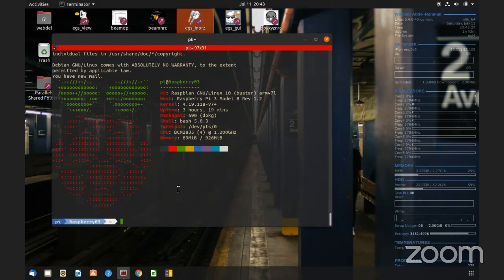With the EXB, it's a new way of parallelizing things. Basically, it does it in a smart way. It has like a basket, let's say of 10 million. And then each program running on a core will take, let's say, 1,000 of these 10 million, run it, and report the results. Once it's done, it will go and take another 1,000, and so on, okay? So at a given time, it's simulating a small number of particles or histories, let's say 1,000. I don't know exactly how this split is done.